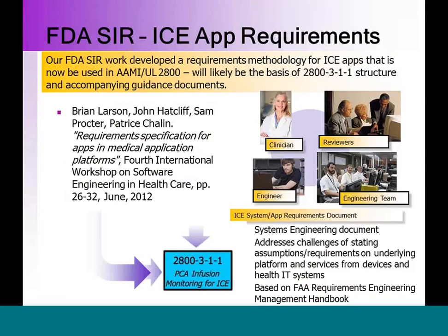And so it would be the same. The idea is that they would recognize this entire framework as being viable, but they would scrutinize the appropriate implementation of the framework and the fact that there were these third-party organizations set up to do the compliance evaluation and safety evaluations, which would then be packaged up and presented as part of the overall safety case for the regulatory claims.